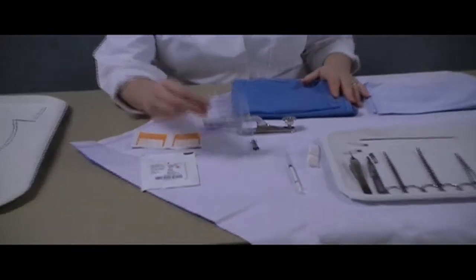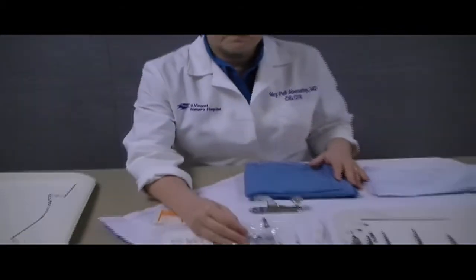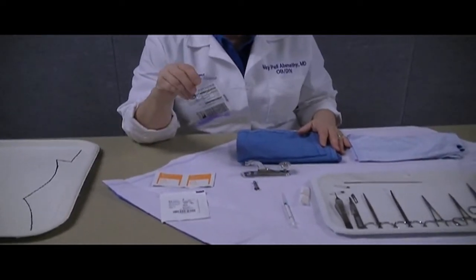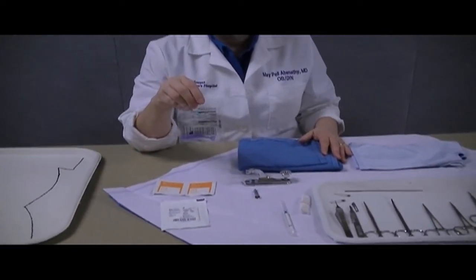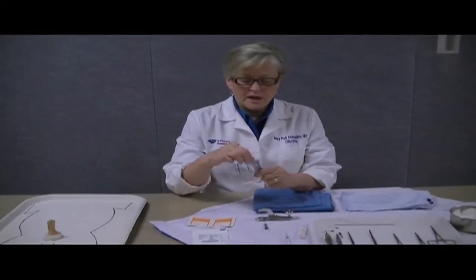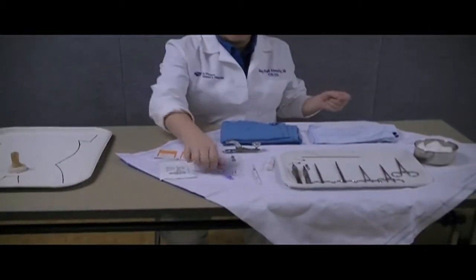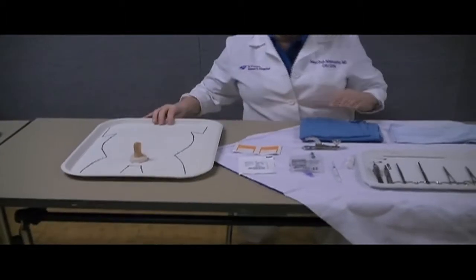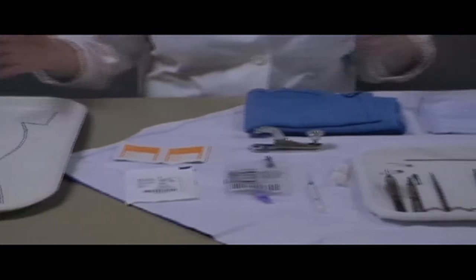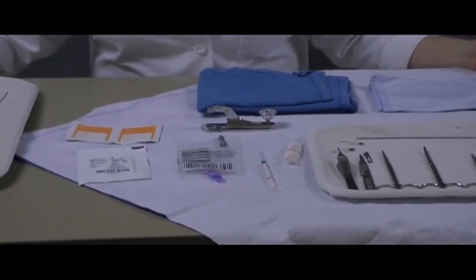In addition, because we wanted to make sure that all the sights and sounds are folded into the memory of the student, we also got the Sweet-Ease that we use as part of our anesthetic during this procedure for the infants. And we opened it up and actually had all the students taste the Sweet-Ease so they would know exactly what it is. So each table is set up with the circumcision tray as well as the infant foreskin as shown in the picture now.